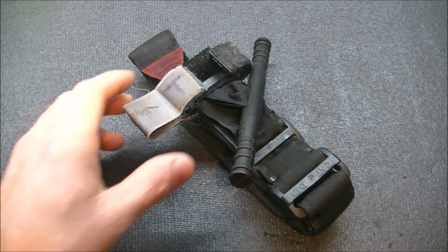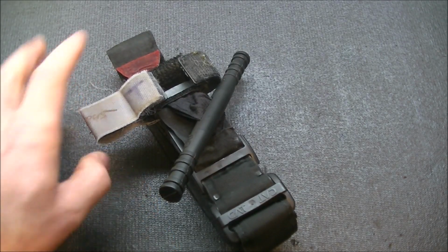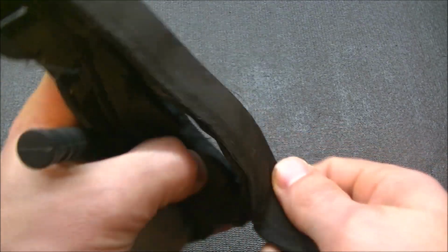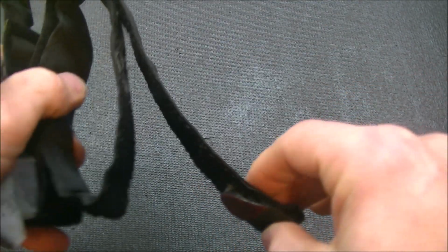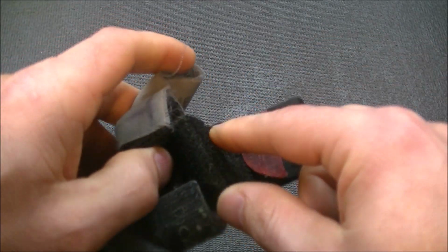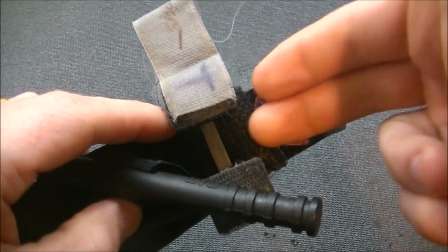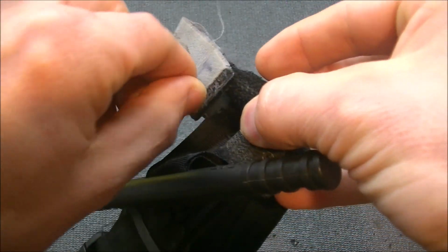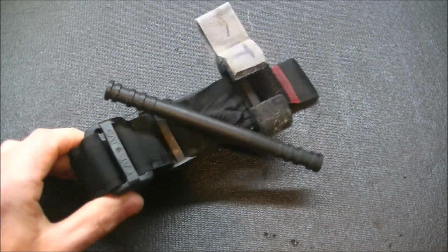Now, to add to the Velcro problem, it's very susceptible to snagging, because once it's on and attached, there will be a good amount that is just hanging off, and you have to find a way to secure it. Typically the way to do that, once the windlass is tightened down, is to take the extra bit and put it through here and put this cover over it and secure it in place. That's the best way to do that.